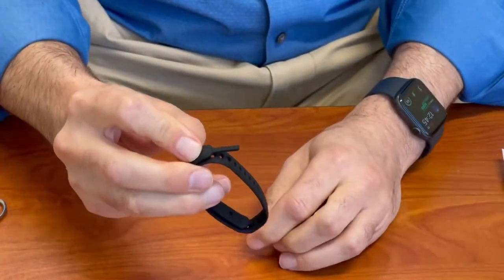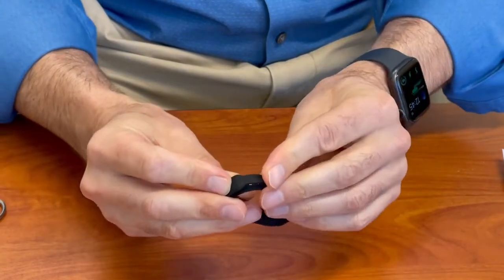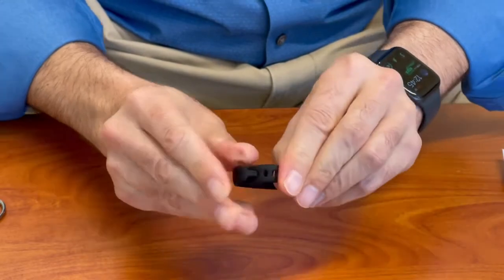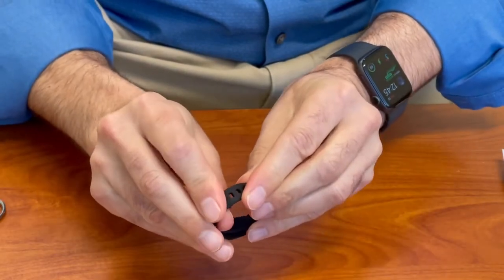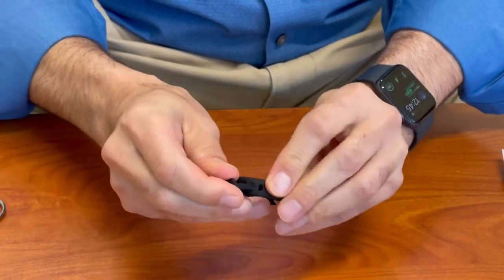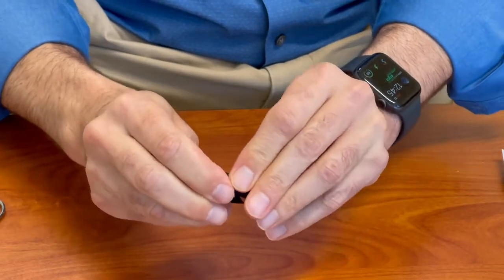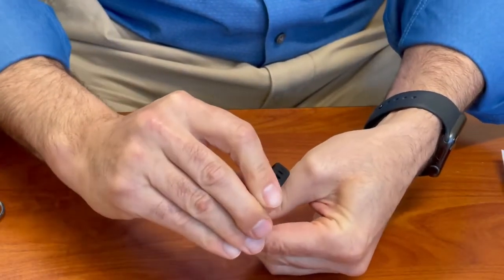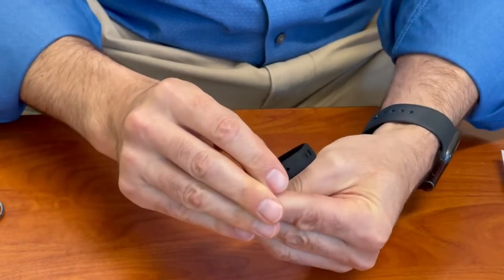And then repeat the process over here on the other side, find the right perforation, place it down and through, and then go through the same locking process on that side.